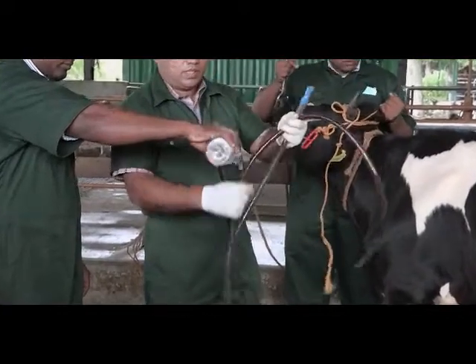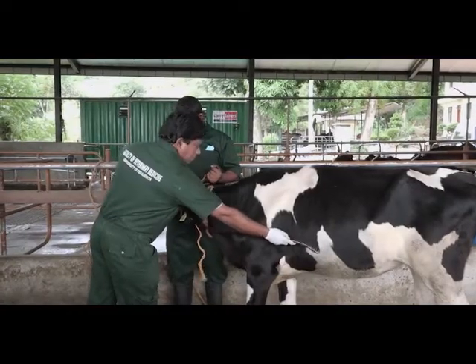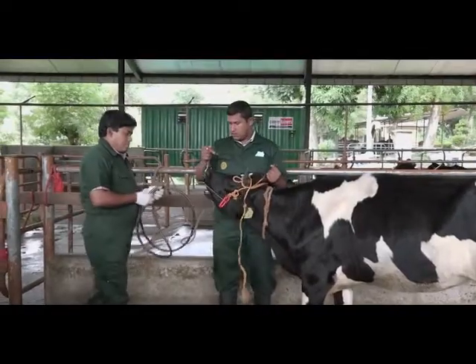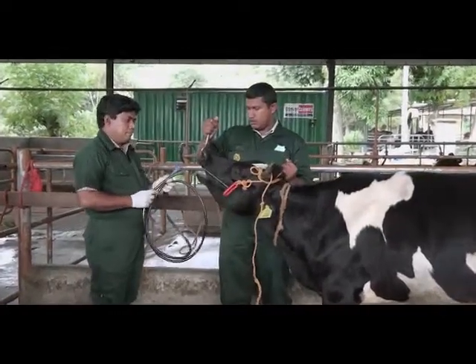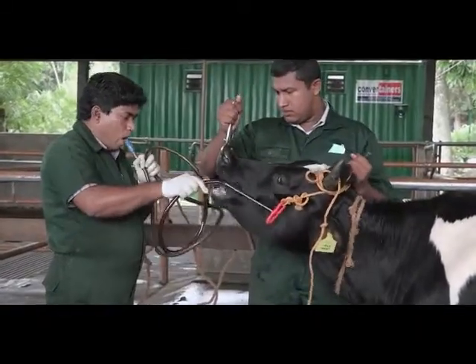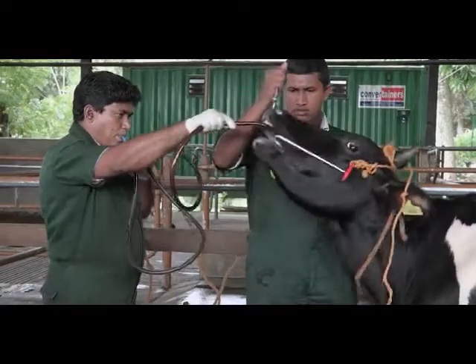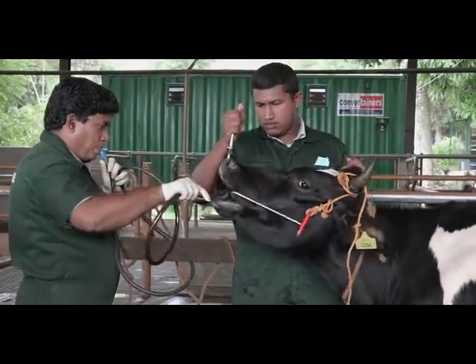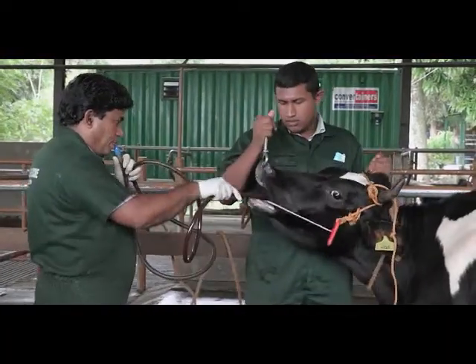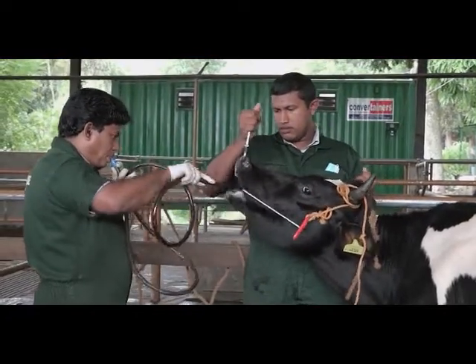Before inserting the stomach tube, roughly measure the required length of the tube to reach the rumen so that you know how much to insert into the animal. Then carefully insert the tube over the base of the tongue into the esophagus. Allow the animal to swallow the tube. While inserting the tube, you can blow into the tube by mouth to facilitate the movement of the tube inside the esophagus without any injuries.